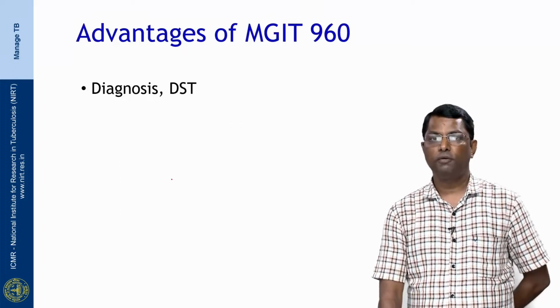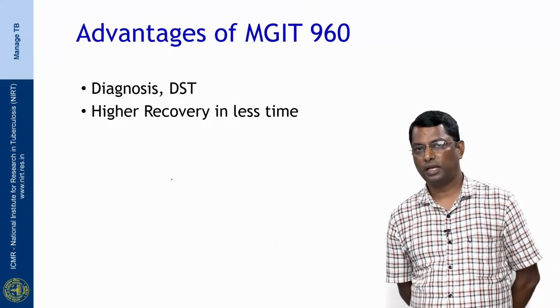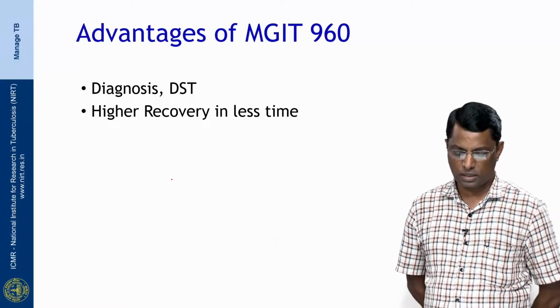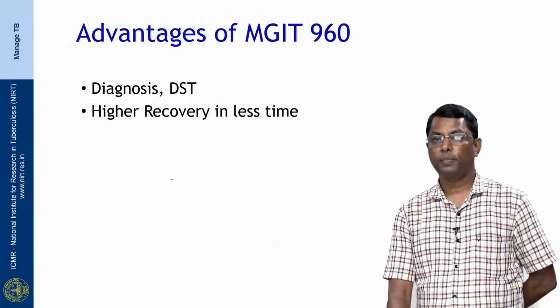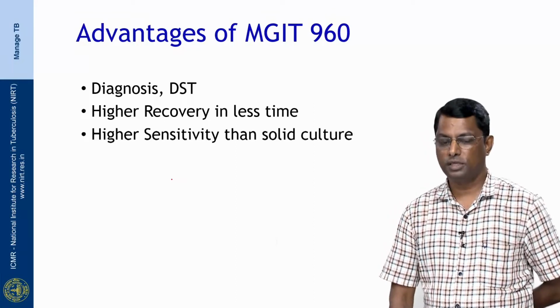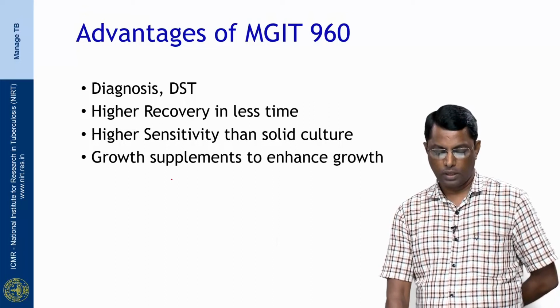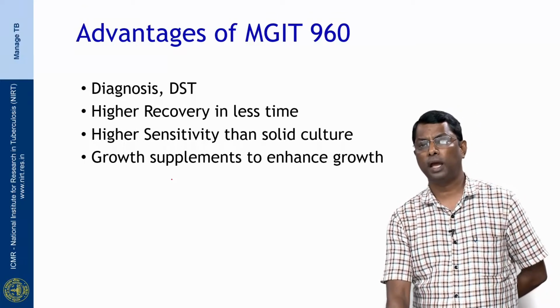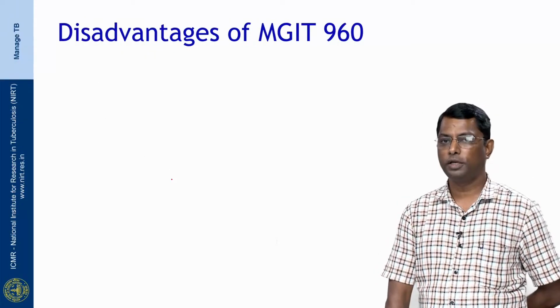Now, what are the advantages of MGIT over the previous diagnostic tests which have been described here? It can do both diagnosis as well as drug susceptibility testing. It has a high recovery rate in less time because the culture medium is liquid. It has higher sensitivity over solid. There are growth supplements to enhance growth. That is why we get earlier growth compared to solid medium.